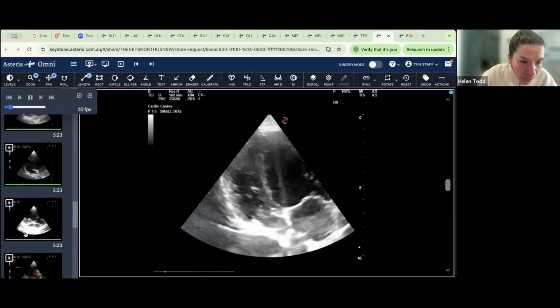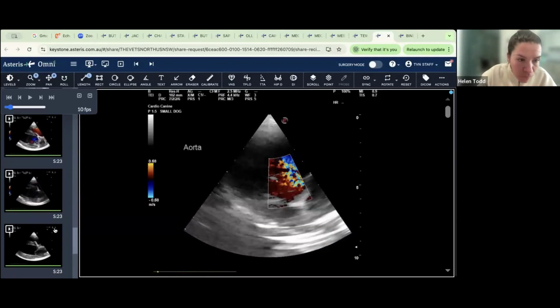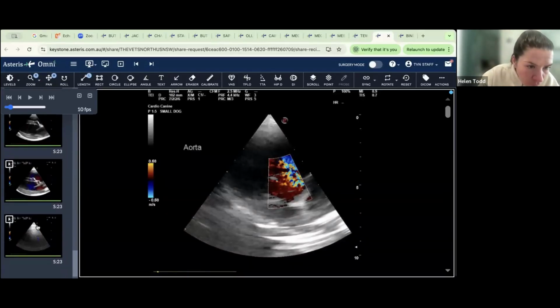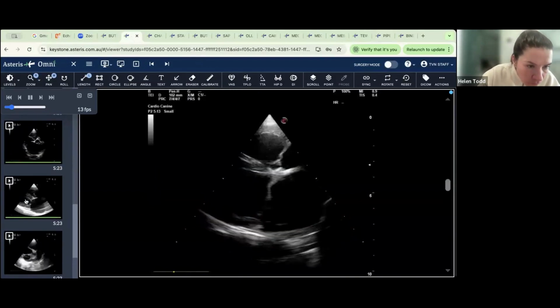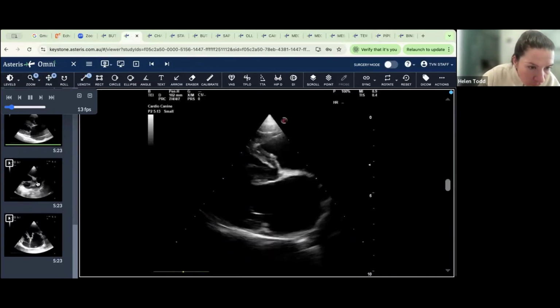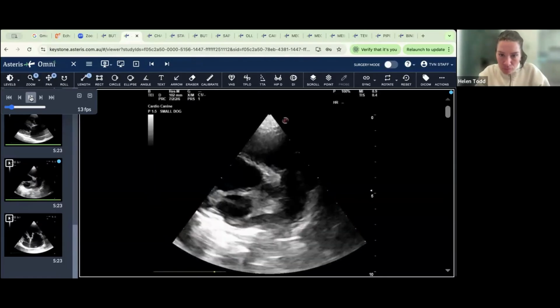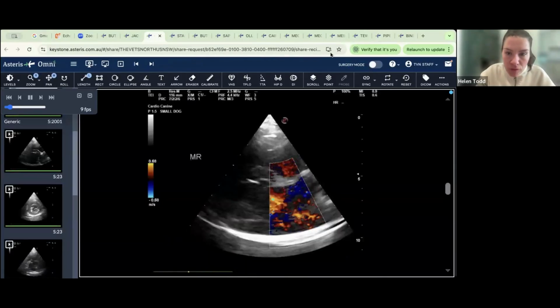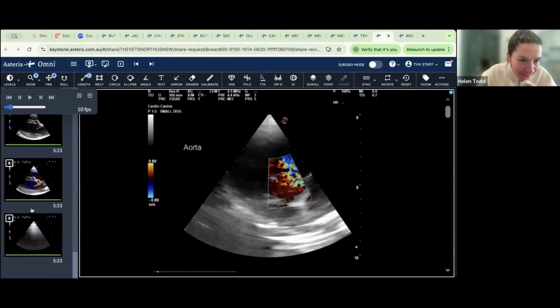I'll see if I've got that view that I mean. No, that's not very good. I mean, I will do, but annoyingly, we take so many videos.